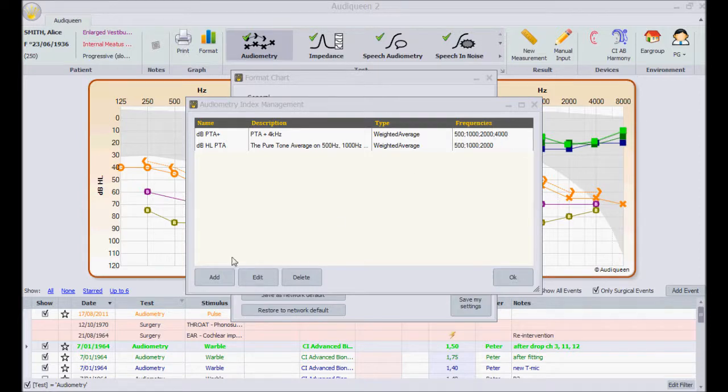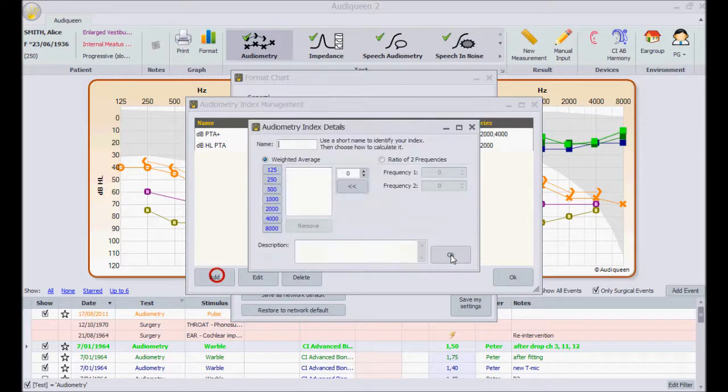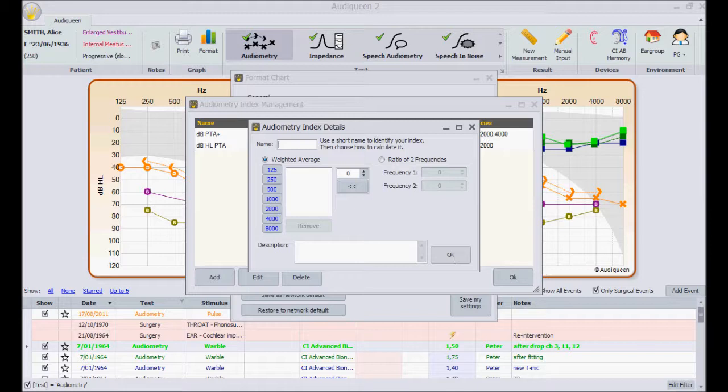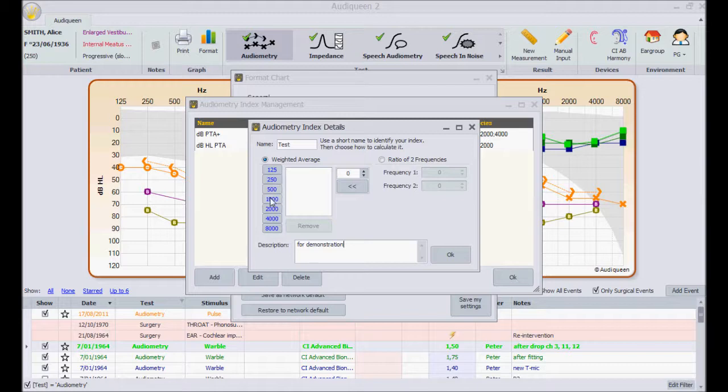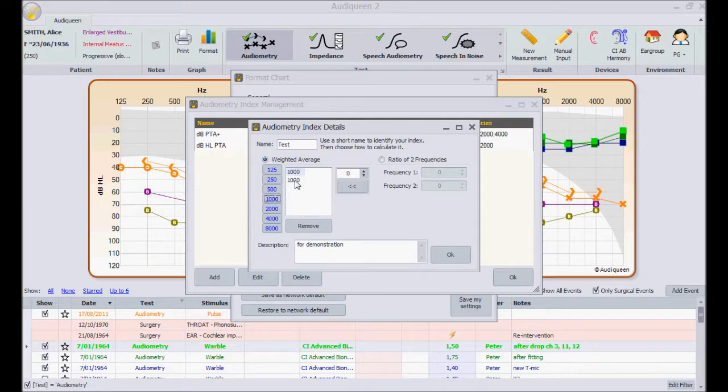I can create another index here. For instance, I can create a test index for demonstration. It calculates the average of 1000, 2000 and 4000 Hz.